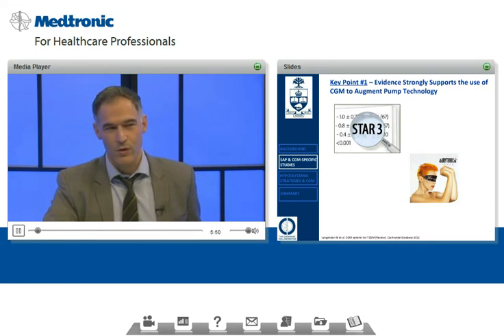So as many of you know, the Cochrane Collaboration has a number of sites internationally, and they do systematic reviews, meaning they take data from multiple studies around a specific question, and then they put together a summary measure of their effect. And the Cochrane Collaboration has a publication around continuous glucose monitoring for type 1 diabetes. I've kind of dissected out of this 150-page document a number of key points.